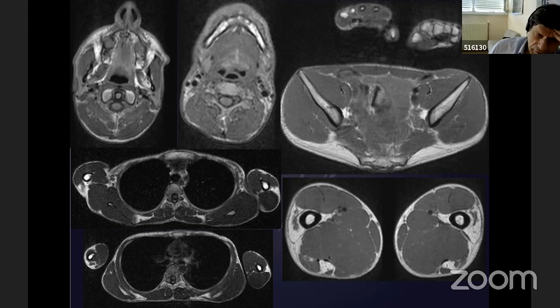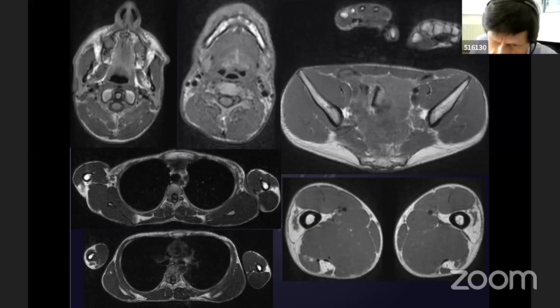For artificial intelligence, in my opinion, it's not very used in follow-up studies, but it could be perhaps. What is important is to use artificial intelligence in pattern recognition. This type of approach permits to detect not only modifications in muscles, but also in the skeleton. You don't have the same spine deformities in all the congenital myopathies and congenital muscular dystrophy.